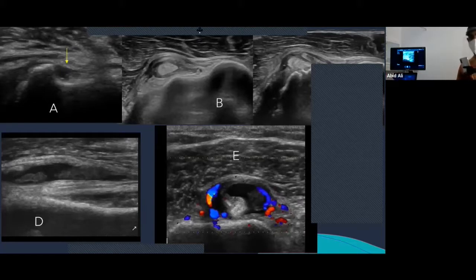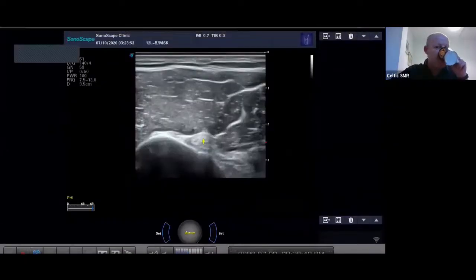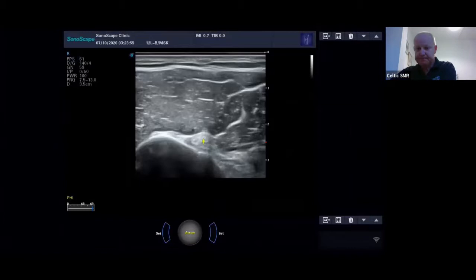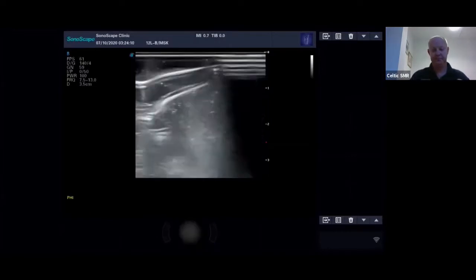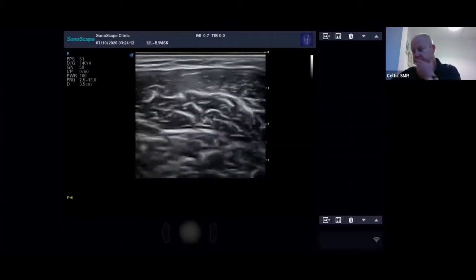Okay, right, so we'll go back to the other one now. So that pretty much covers the long head of the biceps tendon. So we're going to have a look at the distal biceps tendon now. So what I'm going to do is start off with the muscle belly, okay?